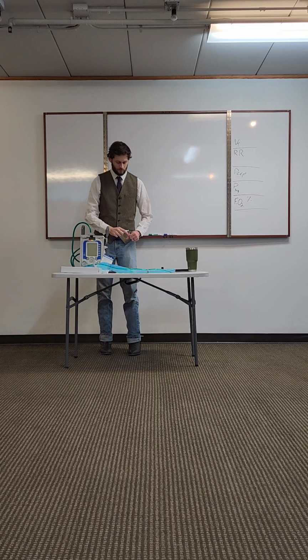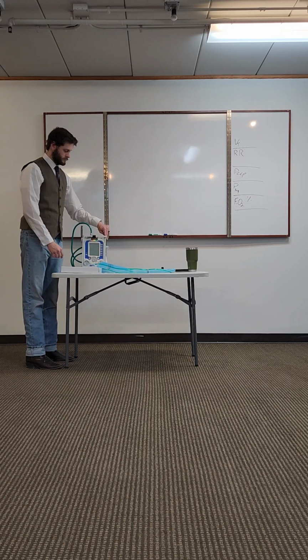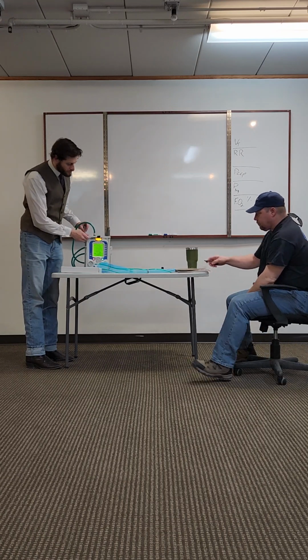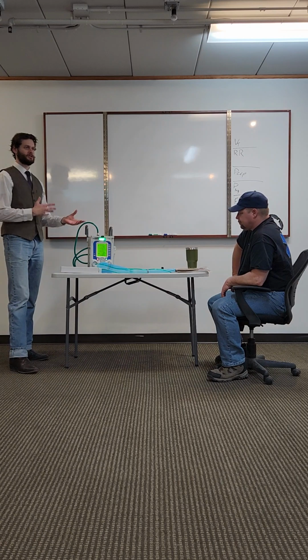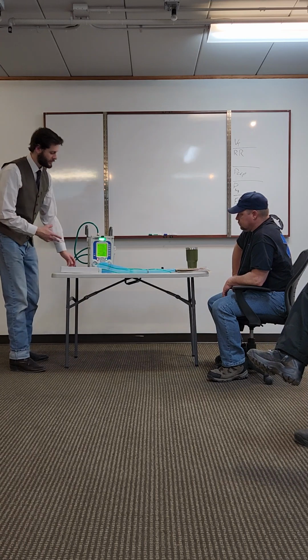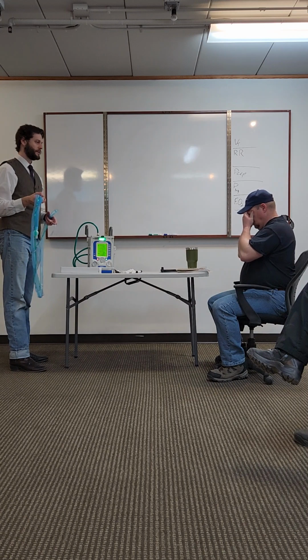Okay. So with the Z-Vent, the first thing you're going to notice is that when you turn it on, it's going to start making this grinding kind of sound. It's supposed to sound like that. It sounds like this because it's trying to detect if there's a patient already attached. With this ventilator, once you start it, it's ventilating. Right now it's not ventilating just because we haven't turned it to a mode yet. But once we hook it up and go to check the circuit, it is ventilating from start.